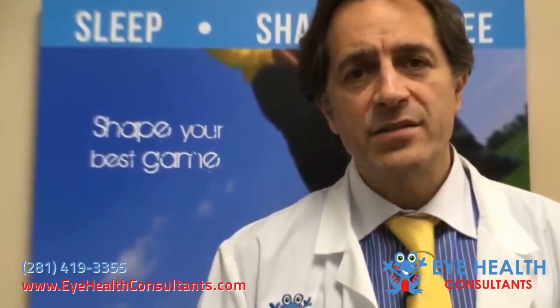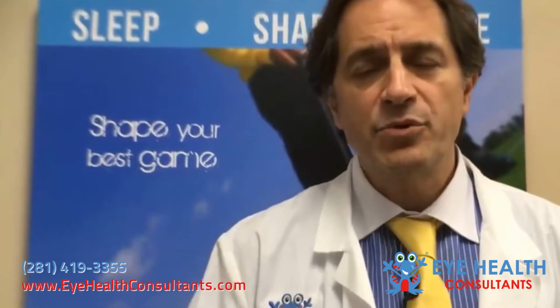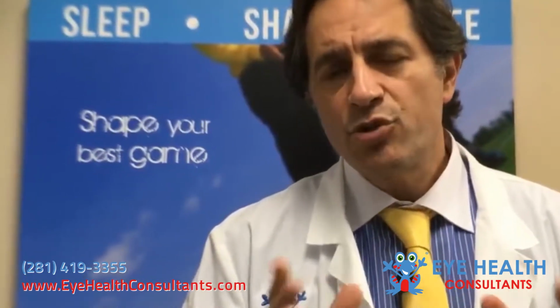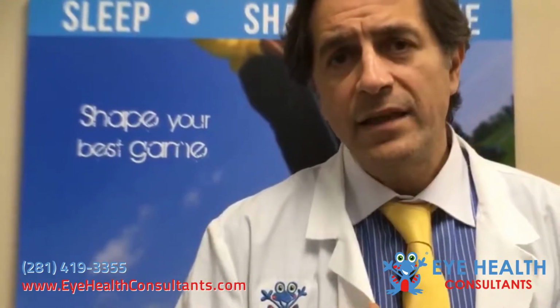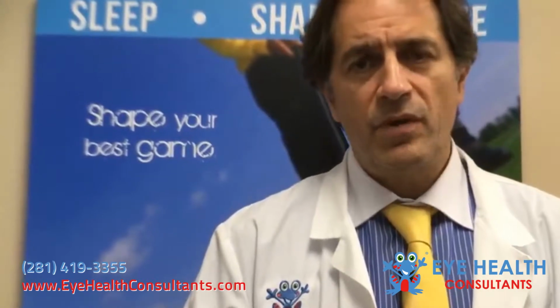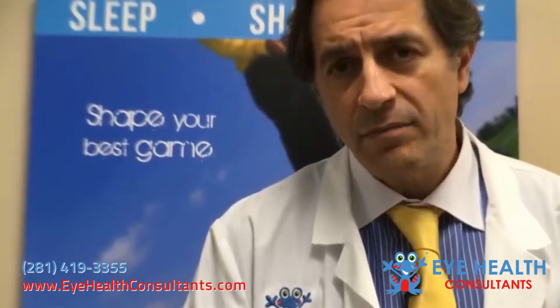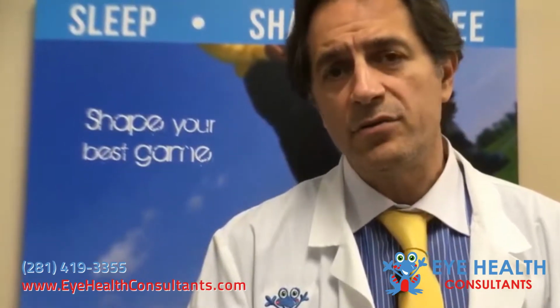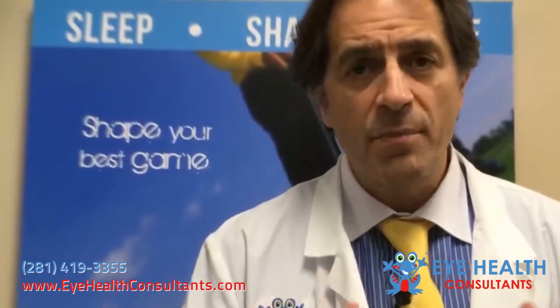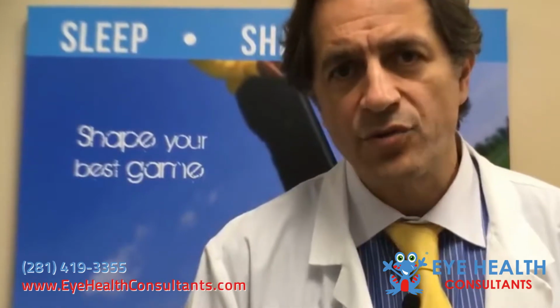Some patients will ask us online, on Facebook, over the phone, well, am I a candidate? Here's my prescription. Unfortunately, it's a little bit more complicated than that. The exam starts by collecting a fairly complete medical history or eye history. We want to know if the patient had any prior history of surgery, prior eye traumas, prior eye conditions, drops, medications, etc. After that, we measure the refractive status of the eye.